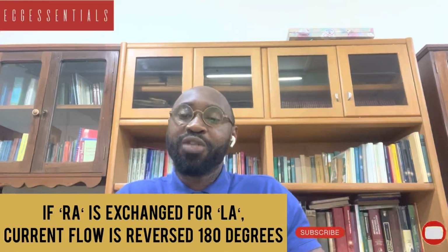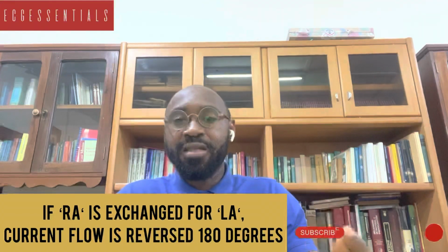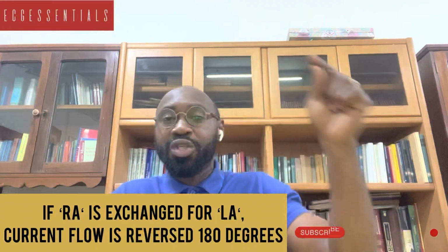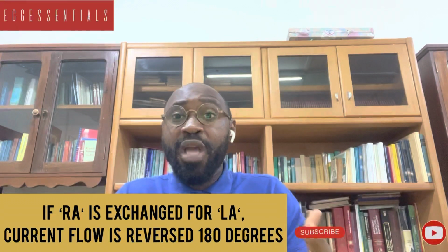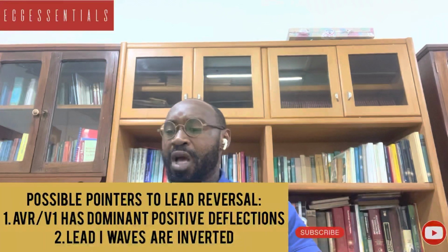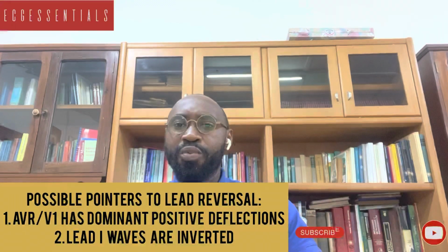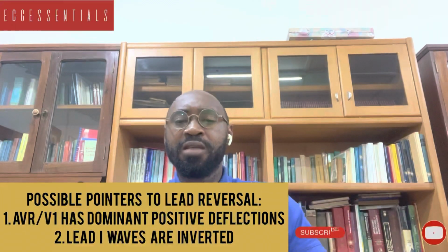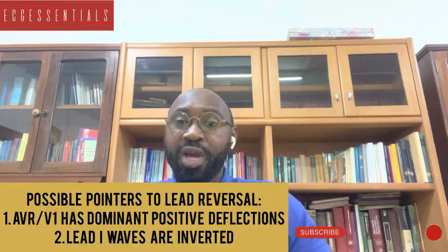Remember, we mentioned that for the limb leads, for instance, if you were to switch from the right arm to the left arm, then everything will be reversed in a horizontal fashion, that is 180 degrees reverse. And a way probably to be able to identify some of this error may be when we see that in AVR, we rather will be having more dominant R wave as opposed to the more dominant S wave that we should expect.